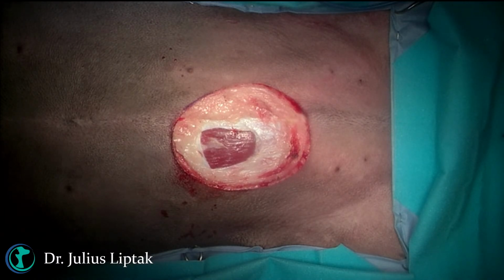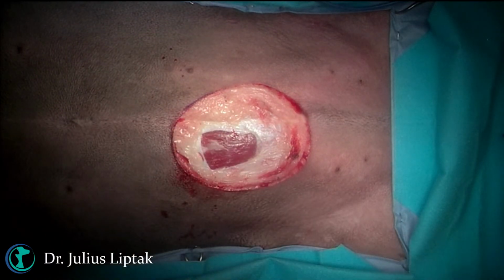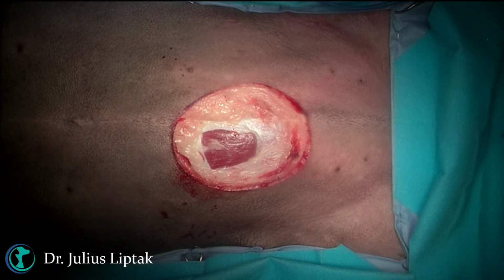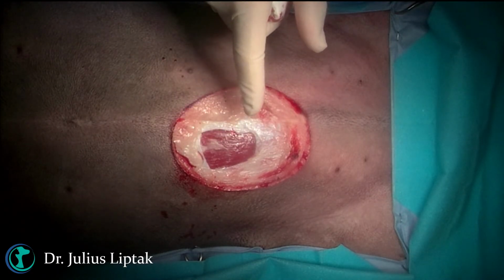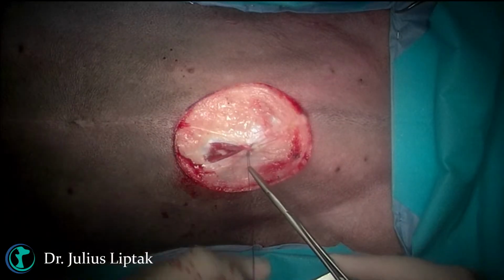Can I have some 0 PDS, 2-0 PDS, 3-0 monocryl, and 3-0 nylon. When you remove the tumour, the size of the defect is very close to the size of the tumour, but maybe a bit bigger.